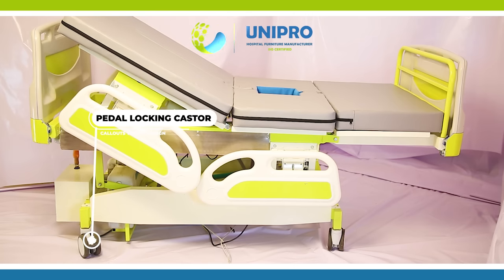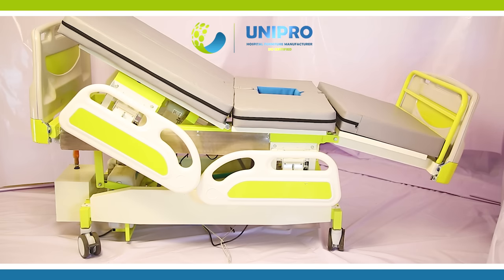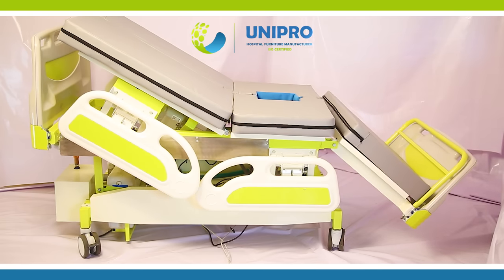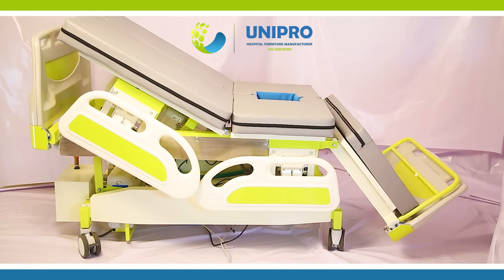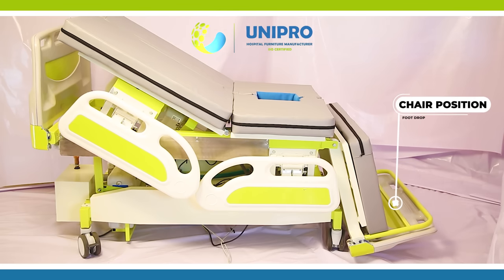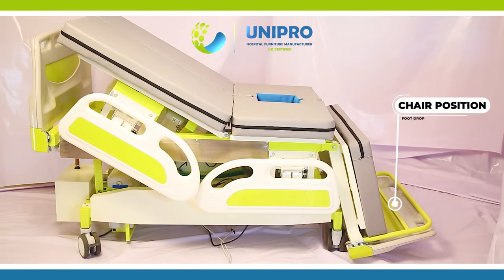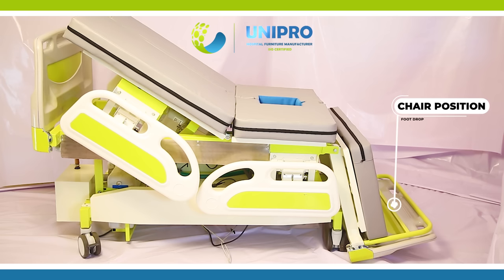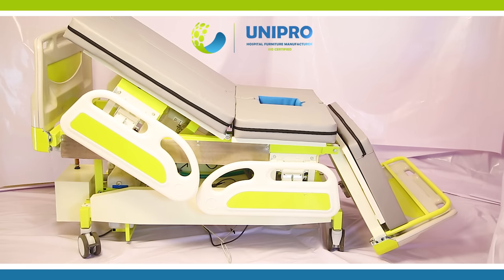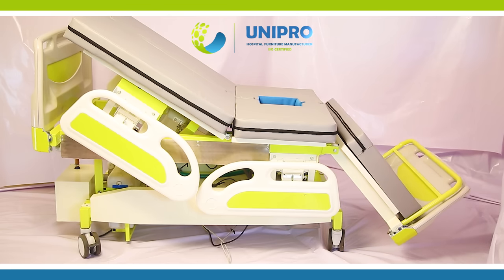Overall Size 214 x 97. Mattress Design as per Model with Density Quality. Product has Warranty 15 Months.